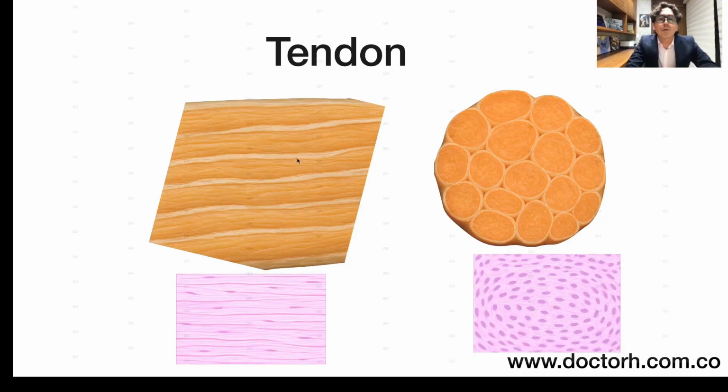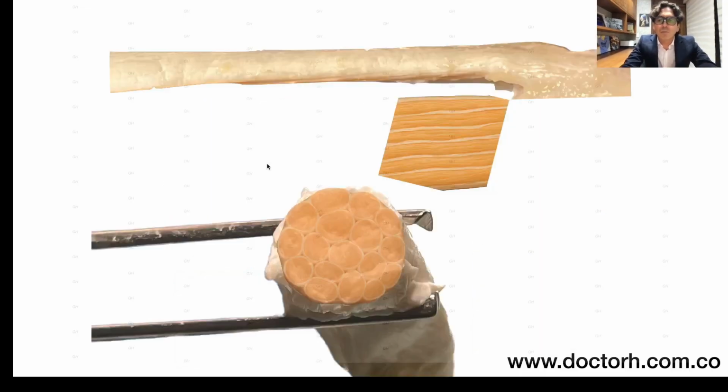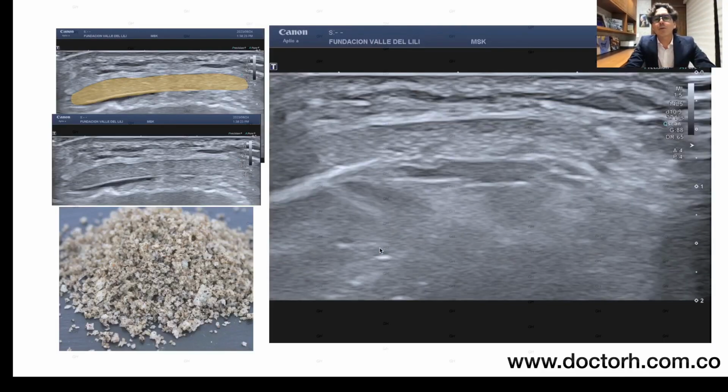These tissues, which are rich in fibers, will produce very well-organized layers. That's how we're going to identify them. So in the longitudinal view, you see a pattern of well-organized hyperechoic layers. This also varies depending on the type of tendon. Some even have, within the different layers, a bit more liquid or fatty content, like the quadriceps tendon, and in the transverse view as well. So we're going to locate some very well-organized fibrous fascicles, which will allow us to identify this image that we call salt and pepper in the transverse view.